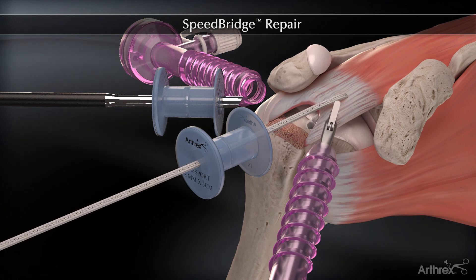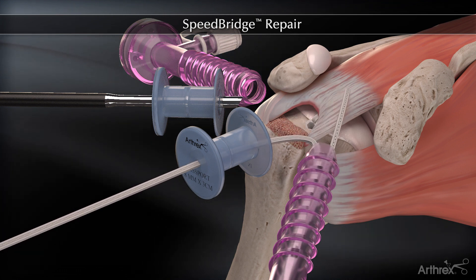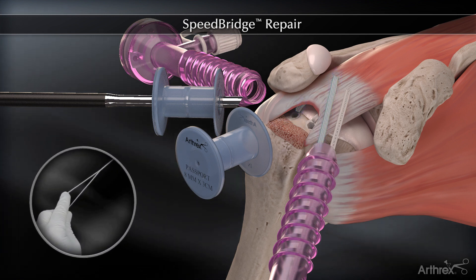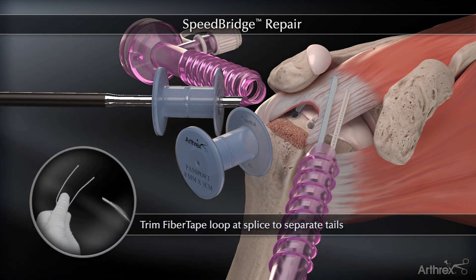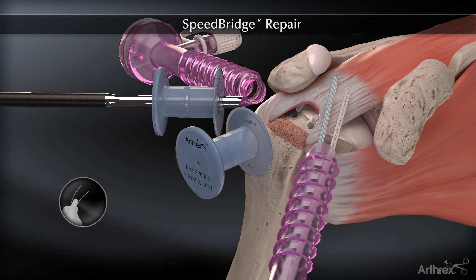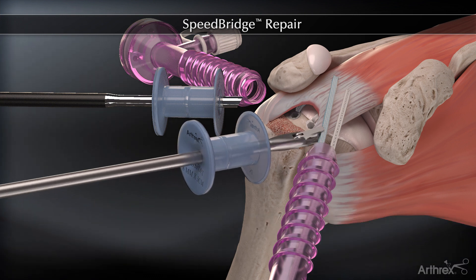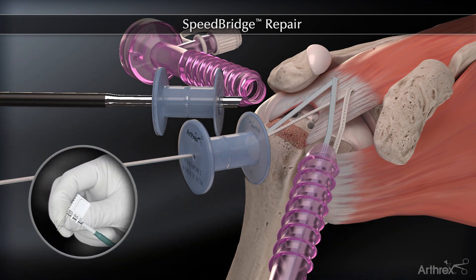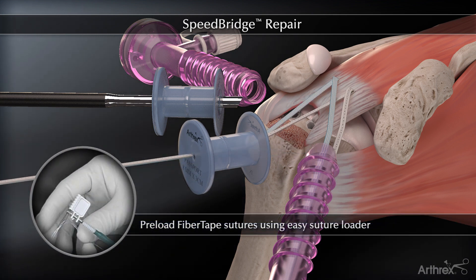The fiber tapes are moved to an accessory portal and the process is repeated for the second medial anchor. Trim the fiber tape loop at the splice to separate the tails. Retrieve one fiber tape from each of the medial anchors, then pre-load the fiber tapes into the swivel lock.